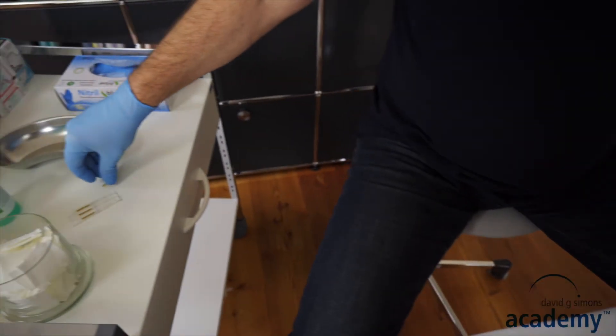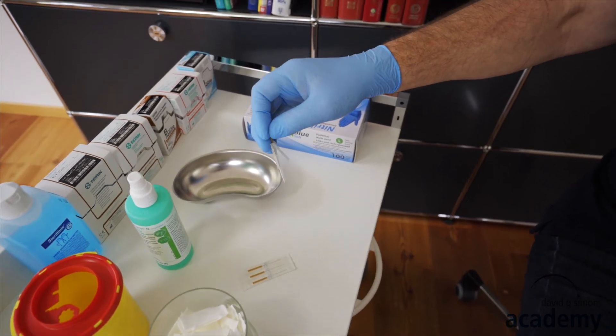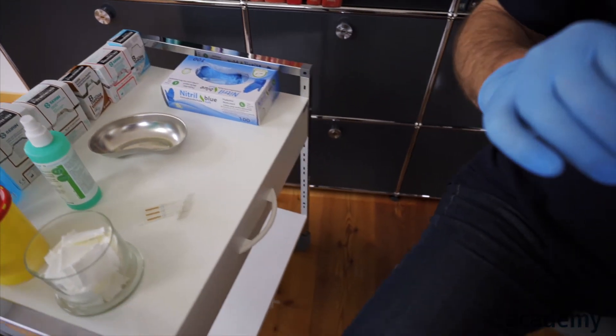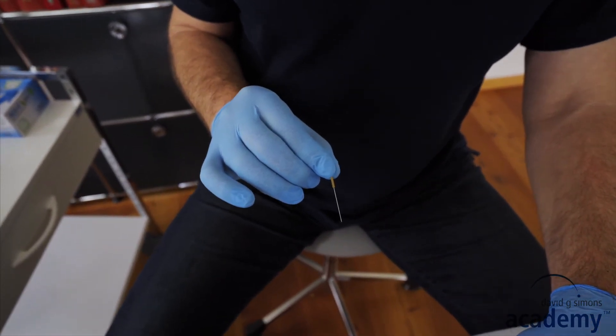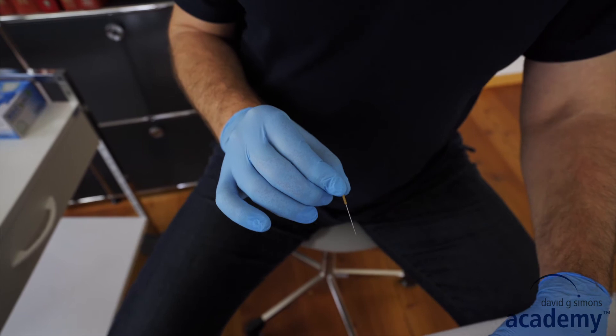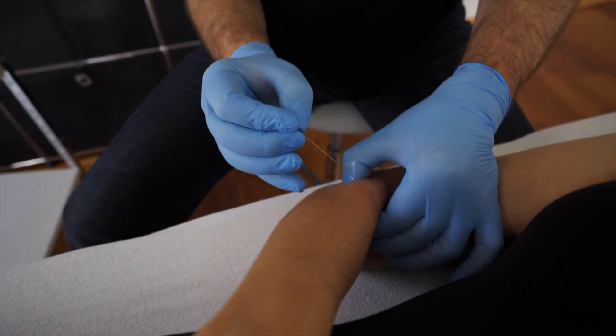Then you can take the needle. Before you use a needle, always check if the needle is bent or if it has any other damage. Then you're ready and you can insert the needle.